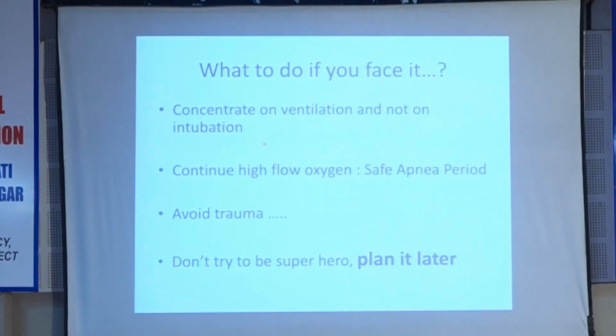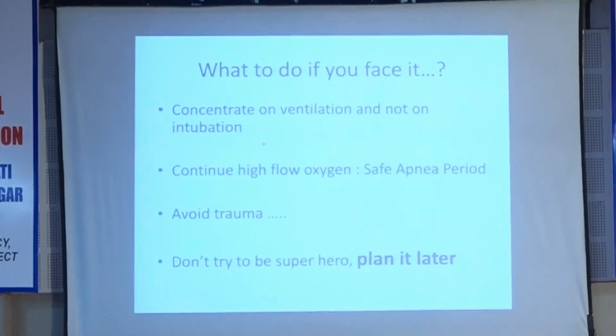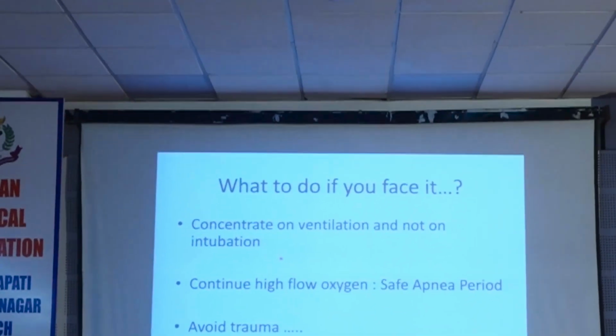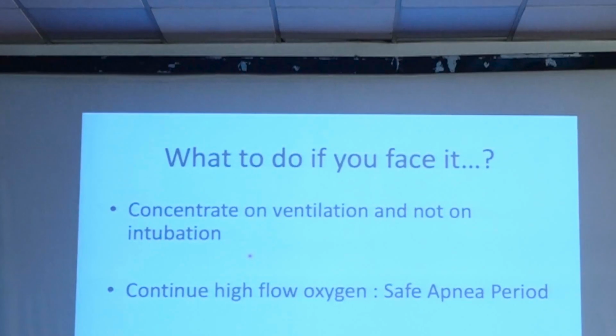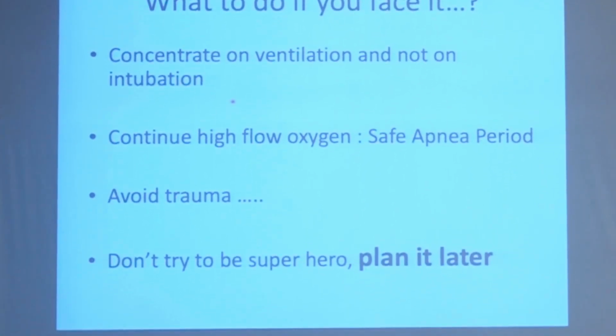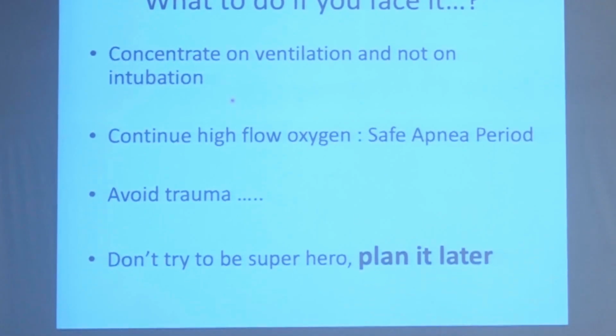In whatever intubation you are going to do, always continue with high oxygen, or at least oxygen flow by nasal oxygen or mask, because it gives you some degree of safety. It offers you a safe apnea period. I will give you one example. When we do brain death testing, we disconnect the ventilator and collect the ABG sample, and we want to see that even after a rise in PCO2 of more than 10, the patient is still not breathing, which is one of the signs of brain death. So for that patient who is not breathing, we disconnect the ventilator for more than 8 to 10 minutes.